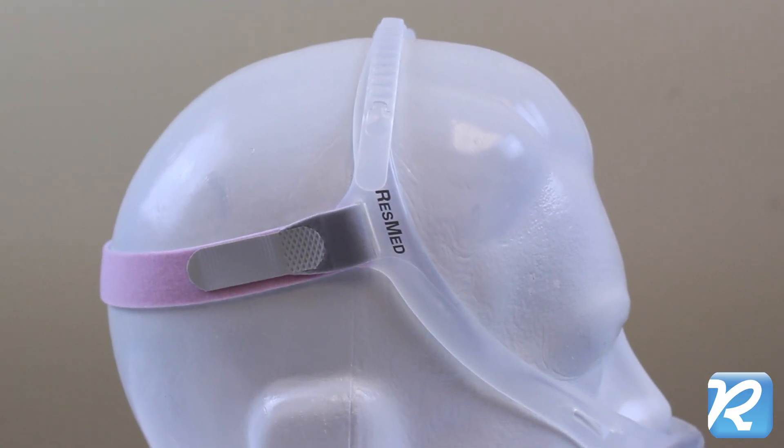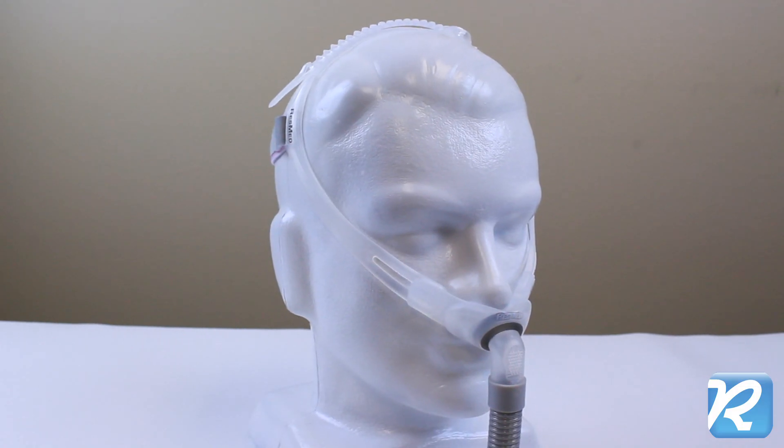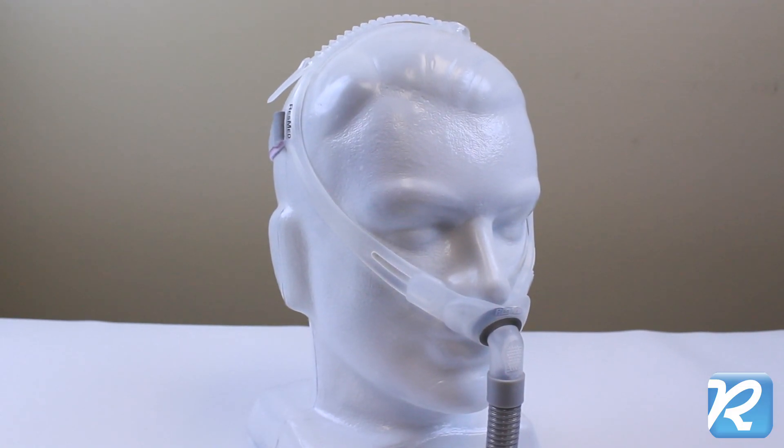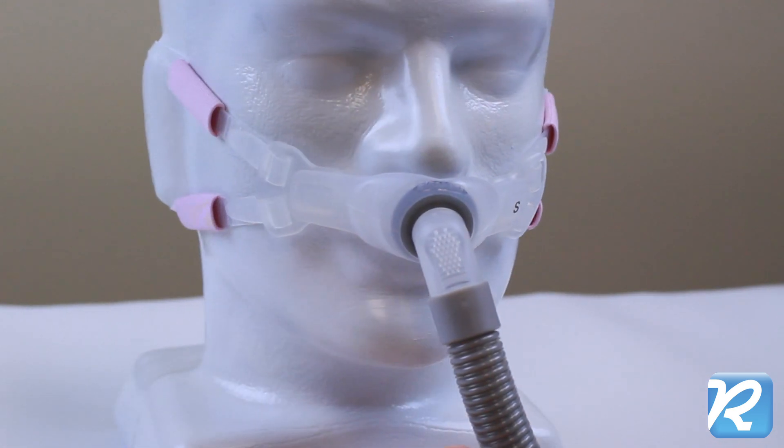The original SwiftFX silicone frame and head strap are also included. Try out both options and pick the one that works best for you. A swivel adapter and 12 inches of flexible tubing prevent downward drag on the mask.